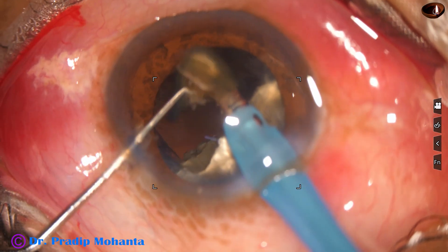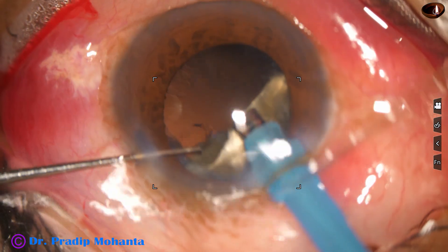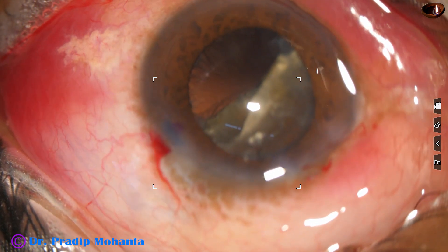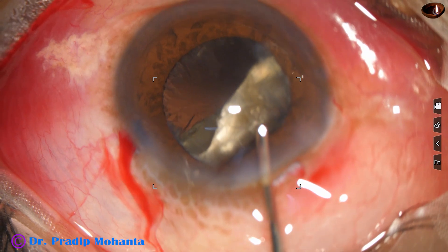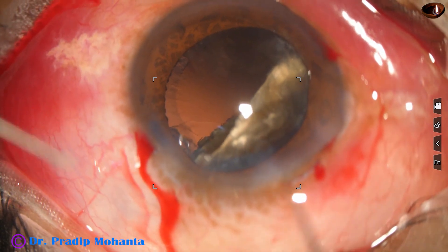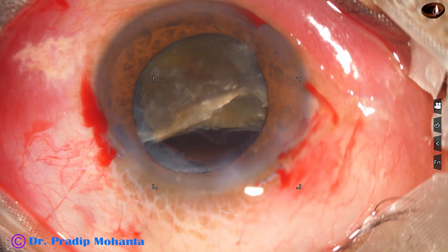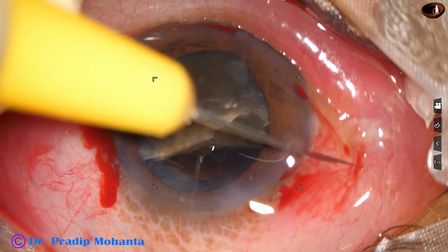This apex is first made blunt. As I try to rotate the semi-nucleus, I struggle — so I come out. Any struggle, come out. Do a safer technique. Inject viscoelastic. Now I will use a hook to rotate this; I am using actually two hooks. Very easily we can rotate and place it in such a way that we can attack this large hemi-nucleus and divide it into two pieces. One more nick to decrease chemosis.